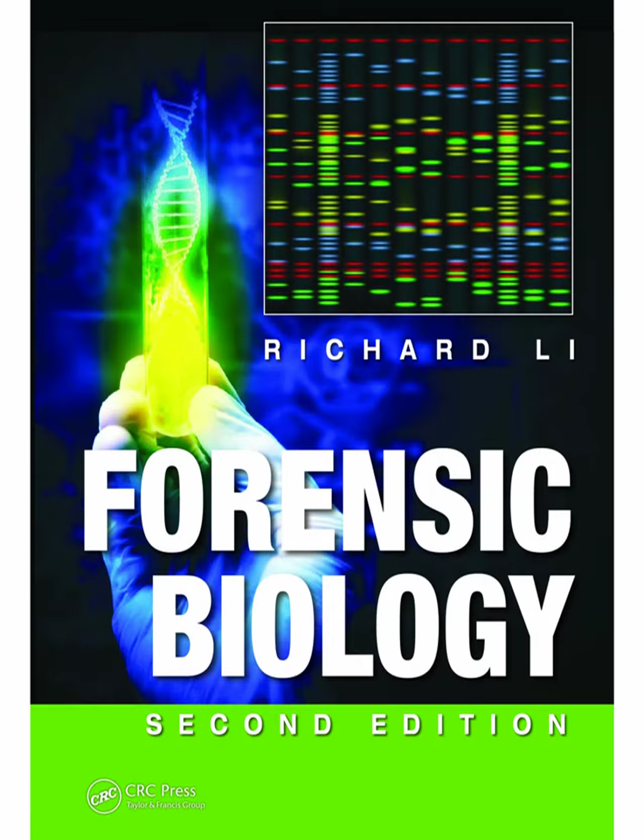Now, one big theme cutting across all of this is evidence consumption. ELISA, DNA extraction, RNA analysis, they all use up some of the sample. Which is a major concern, especially when you have only a tiny speck of material. You might have just enough for one analysis. Do you use it for serology to confirm it's blood, or do you go straight for DNA and hope it's relevant? That's the dilemma. Which leads us to the need for non-destructive assays, techniques that can identify the fluid without consuming the sample. Absolutely critical.